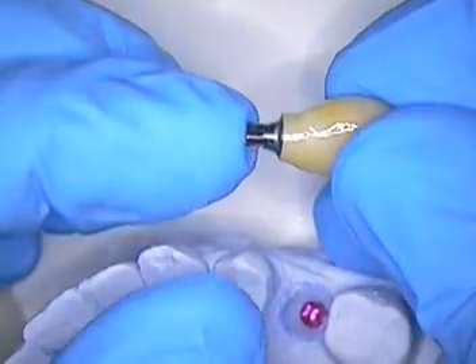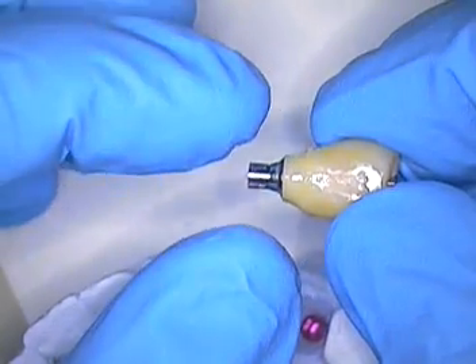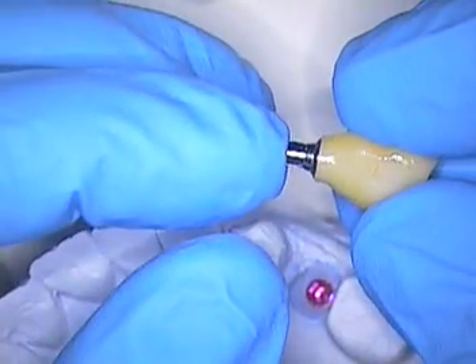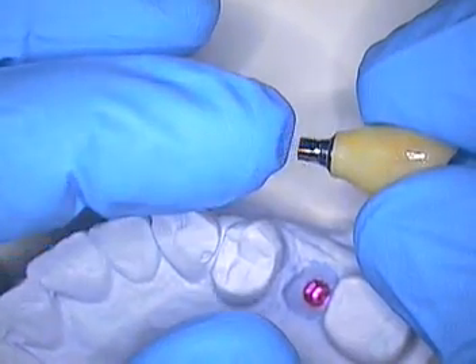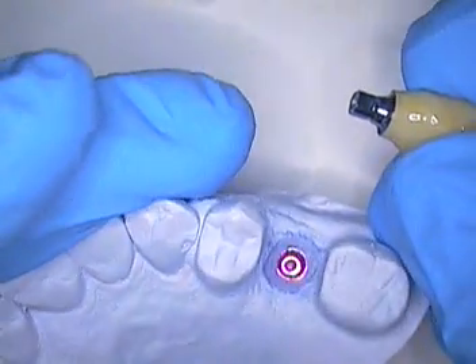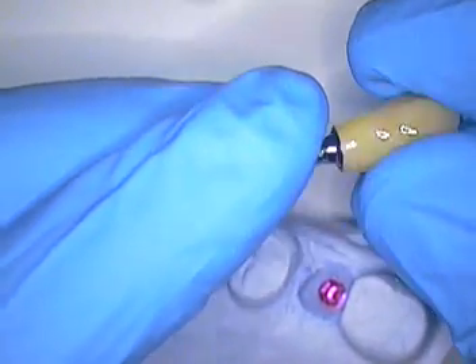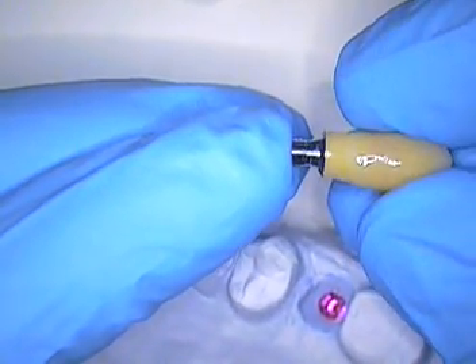I suspect for the audience out there — if you've had a full zirconia crown and abutment made in one piece — would it be strong enough to hold the patient's bite? I think that generation will definitely surpass this technique and make placement a lot easier for the restorative dentist. Right now, this will blanch the tissue and cause some trauma subgingivally. There's just no way I can put this in as it is. This is a little prelude to some newer technologies, but certainly some things that have to be addressed.